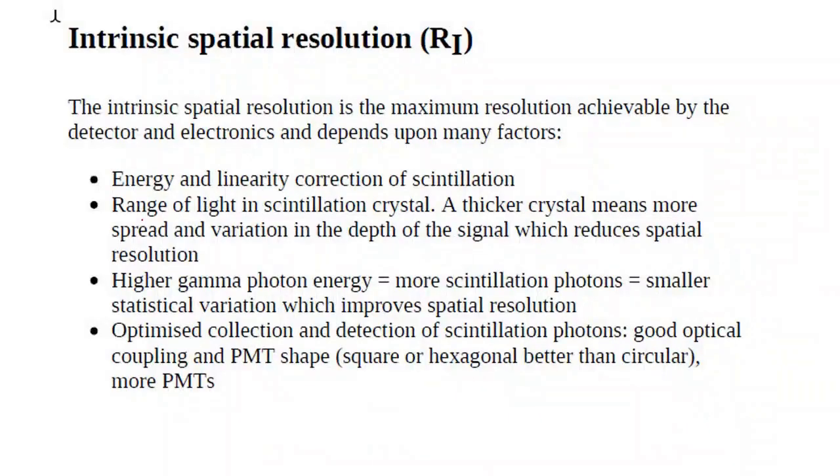For example, I have a radiation detector. You want to measure a specific type of radiation, let's say technetium. This technetium emits 140 kiloelectron volts. So, you take this detector and perform a calibration. What does calibration mean? It means adjusting its settings.